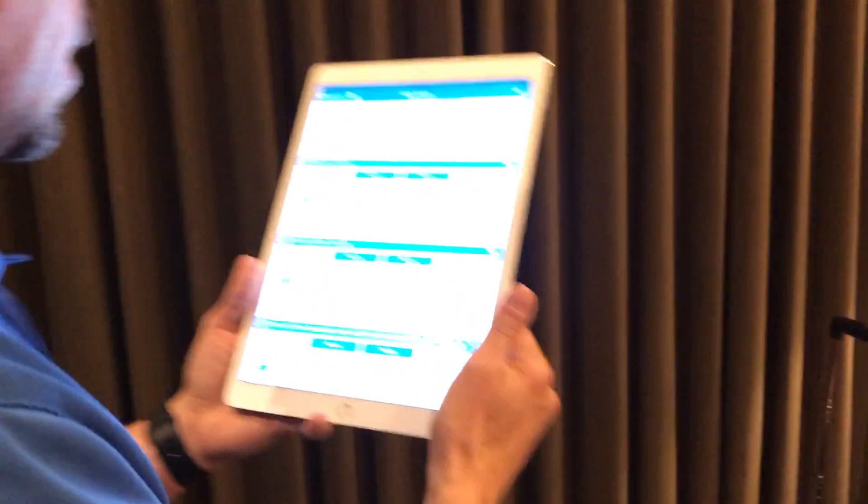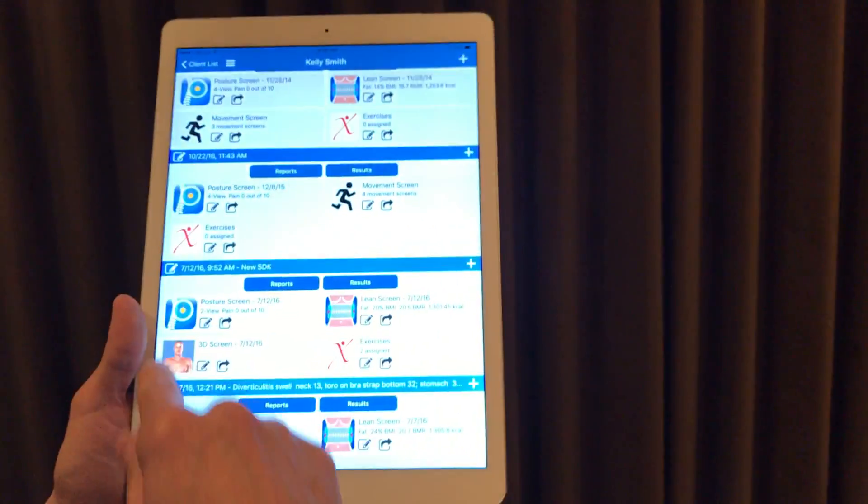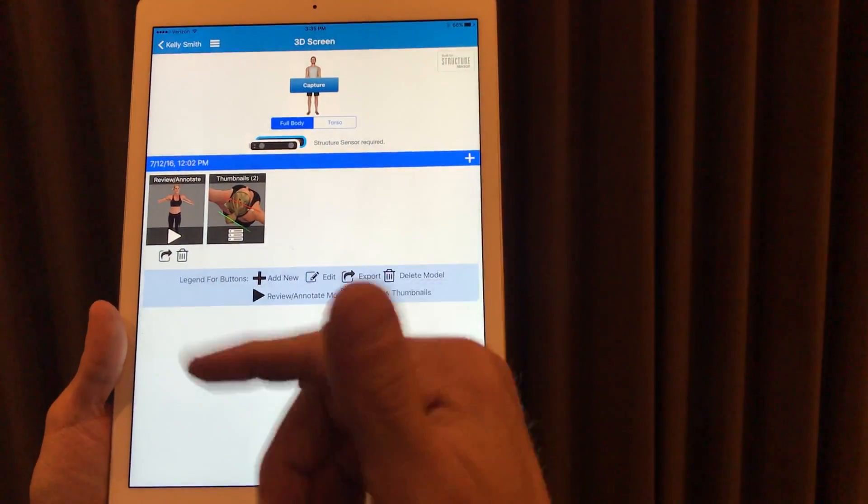We're going to always tend to evolve this product. In this first version we're measuring the most important features and areas that we need for body composition, as well as what fitness professionals and doctors are monitoring when a person is going through a weight loss or fitness regimen. I've already recorded some scans, so if we go right in here I'm going to go ahead and go into my 3D capture.